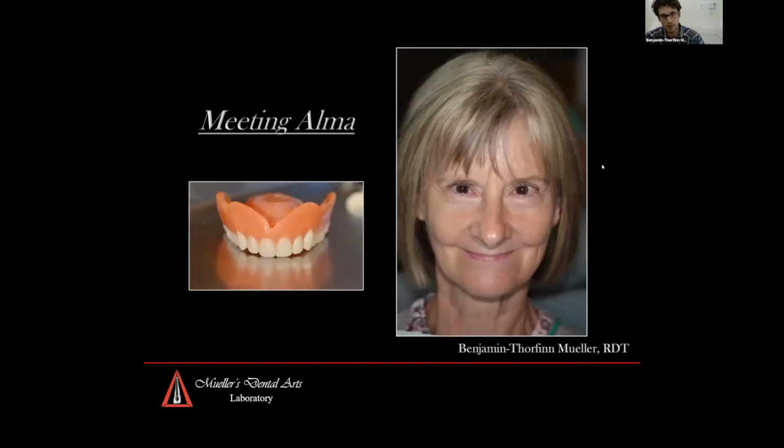So this is our patient. Her name is Alma, and she came to us as a denture patient. She had a very old denture that is very cookie cutter, very bland looking by now. Of course, it's been probably over polished several times for relines and things like that. And as much as she was a happy lady, as you can see, she still smiled with her eyes very much, but she did not like to show her teeth.